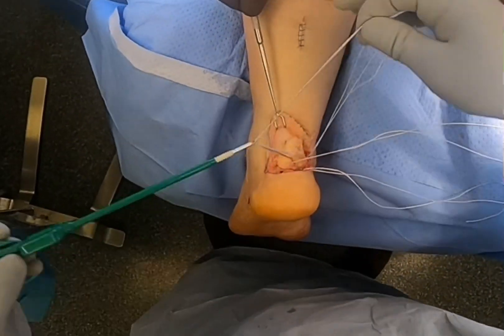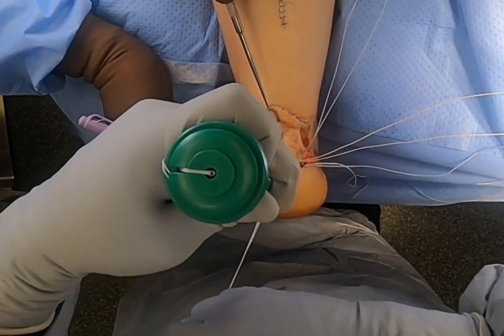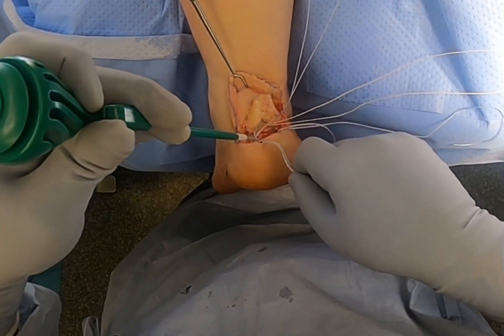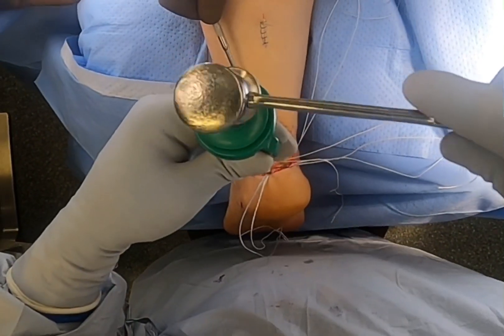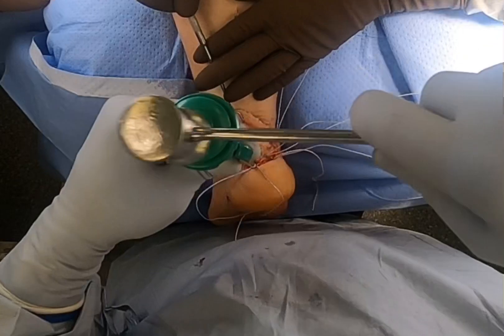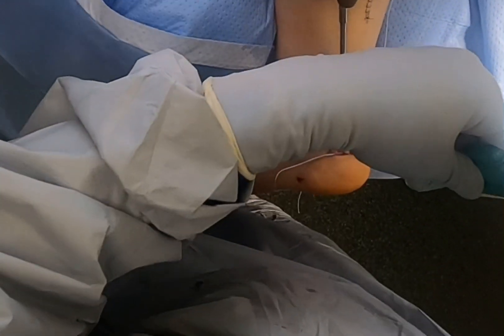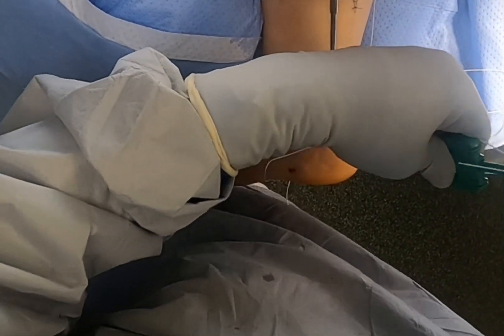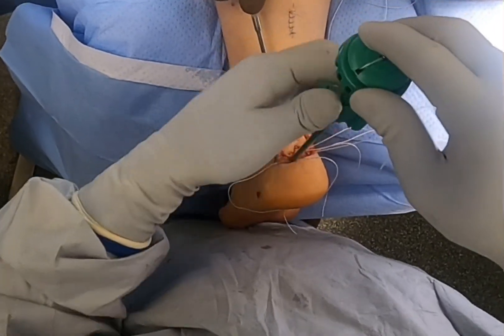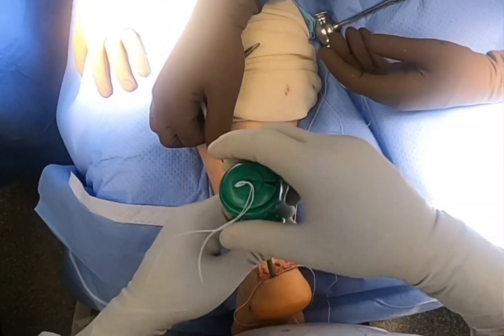Here we are passing that suture through the orange tab. I pull it tight and put the anchor right at the edge of the hole, marked on the laser line on the anchor system itself, which gives me a little bit of room for the anchor to go in. I pull back to the mark and then put it in the drill hole and tap it in — hold and twist. This anchors the suture down in the drill hole. I let the anchor find its way into the drill hole; if you just hammer it in without regard, it can form a new hole and you have to use a new anchor. So you lightly tap it and let it find its hole. Once that's done, you countersink and pull off the anchor handle and the extra suture.